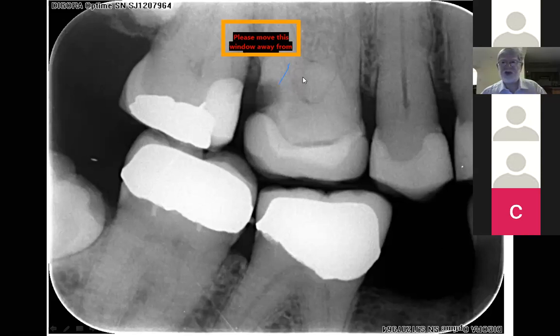Now we're discussing with the patient about endo, rebuild, subgingival restoration, crown with subgingival margins, poor prognosis. Are we going to start talking about extracting the tooth and putting an implant and an implant crown? So everything is going to hinge on whether we have a pulpal exposure when we work on that.